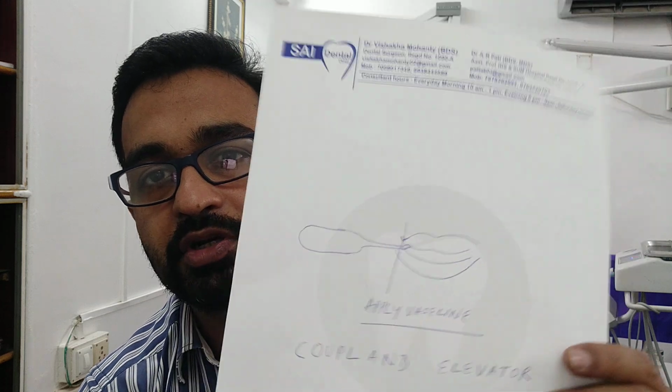Now the last situation comes, the upper third molar. Many people fall into the trap of removing the upper third molar. What is the trap? Sometimes we remove the upper third molar directly using forceps. Never use a forceps. Okay, you can easily remove the third molar by using a Coupland elevator.